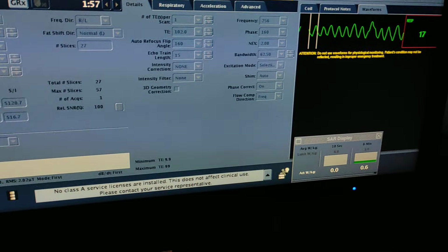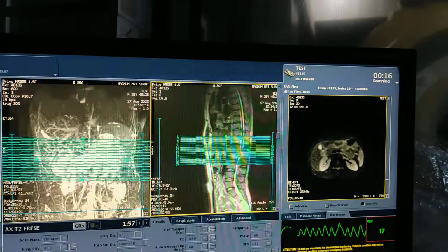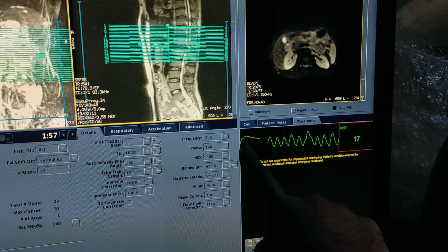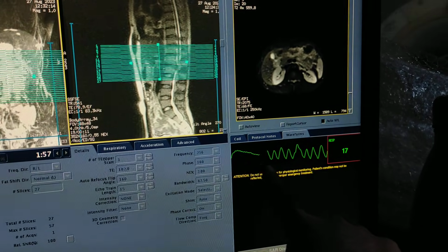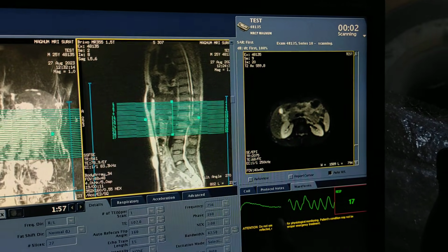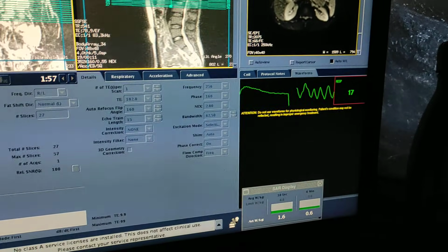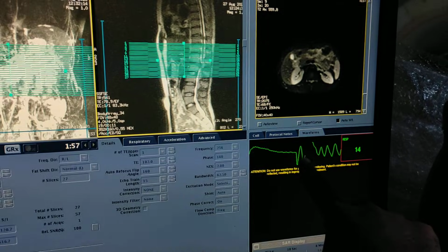सांस रोको, सांस रोको. Now you can see it will take 16 seconds. And here you can check whether the patient is holding the breath properly or not. Here the patient is holding his breath. Now ask the patient to take breath. सांस ले लो. Take your breath properly now. Now you can check over here. Now the patient again started taking his breath.